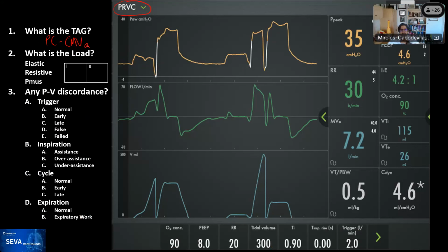And then the final is adaptive. Adaptive means that we have told the ventilator that we're giving a set tidal volume, we set a tidal volume that is a target. The ventilator is not controlling the tidal volume, and the patient can get more or less, and the ventilator is going to move the pressure up and down according to an algorithm.